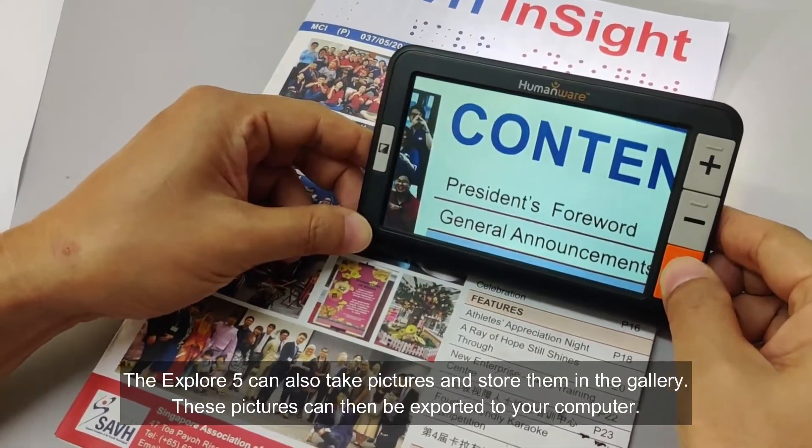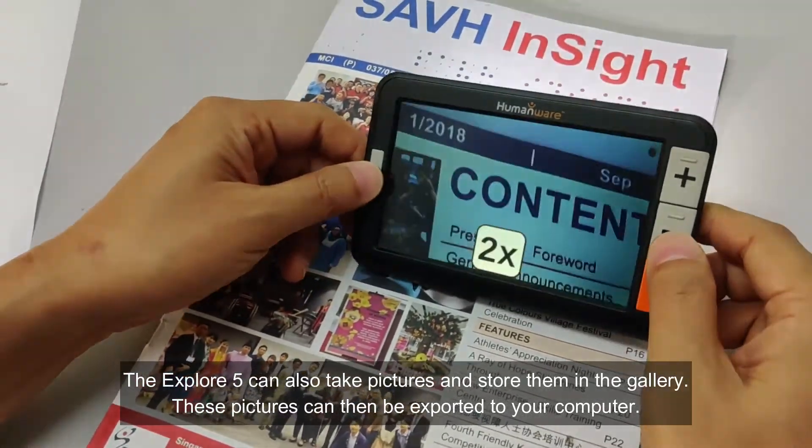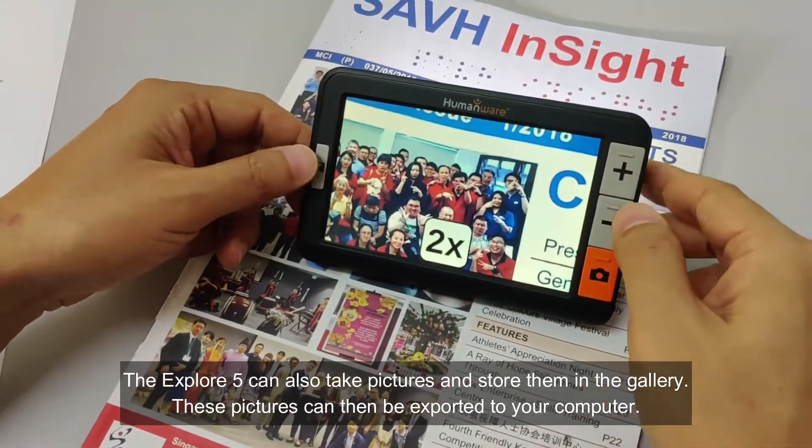There is also an option to have a guiding line or blinds to help with reading. The Explore 5 can also take pictures and store them in the gallery, and these pictures can then be exported to your computer.